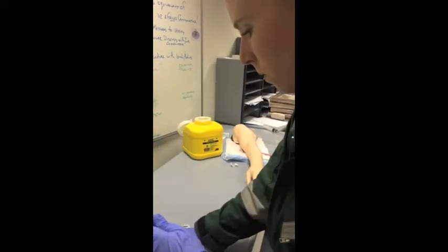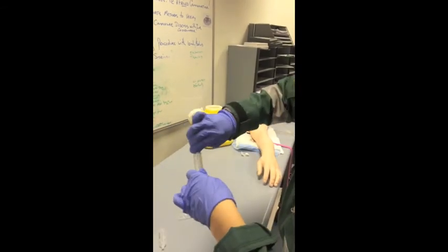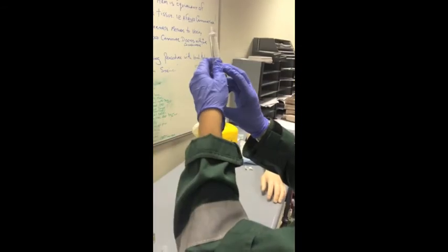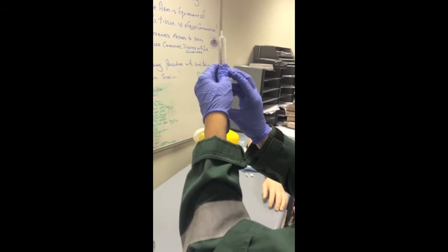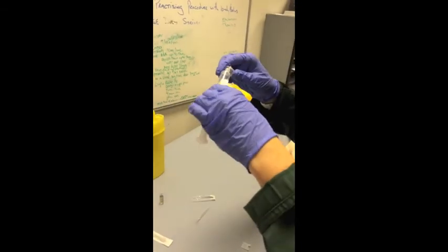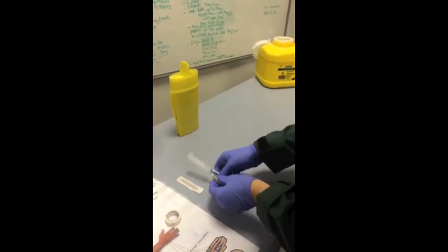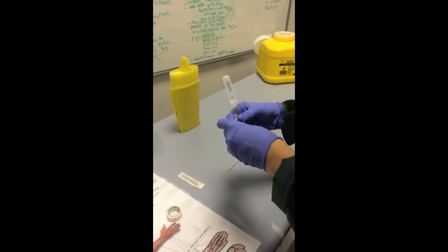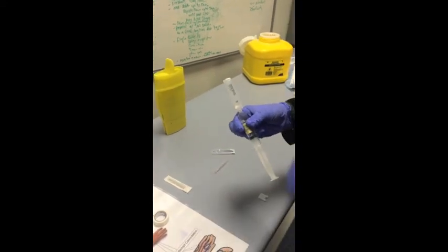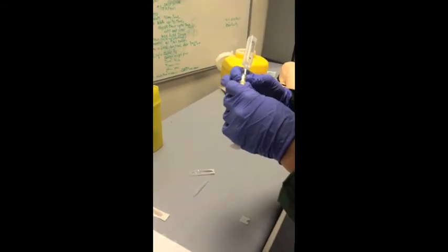I then remove the blunt needle from the syringe with the cap intact and ensure that the titrated fentanyl is measured to the very tip of the syringe, removing any air or air bubbles. I reconnect the syringe with the empty normal saline to preserve sterility of the tip. I then tape the used glass ampoule of the fentanyl to the syringe to enable identification of the medication, its amount, and expiry.